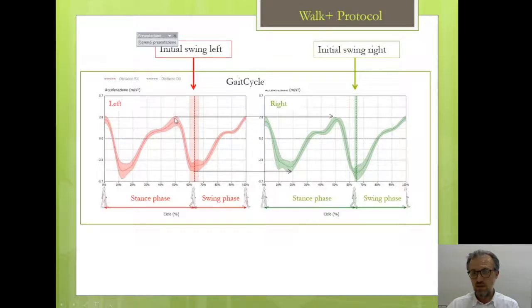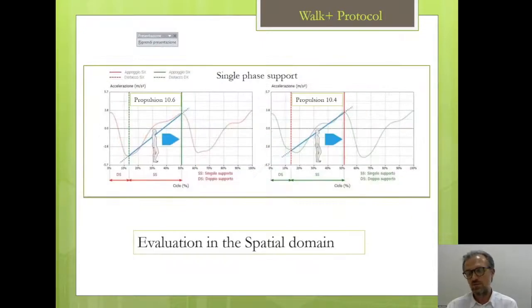And at the same time, from side to side, we can appreciate the index of symmetry between both sides, because it's very easy just to receive data, but even clinical images, such as the one of the EKG, for example, of the index of symmetry as a global parameter that can be used to express a clinical judgment about the quality of the gait cycle of our patient.